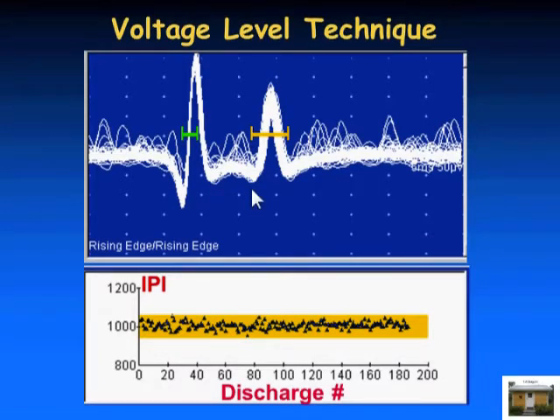They always fire together. And the trigger point at which we acquired these signals is on the rising phase of this first spike. Therefore, it's frozen on the screen. The second spike varies slightly because of the neuromuscular jitter. These windows here represent points at which each of these signals is timed.